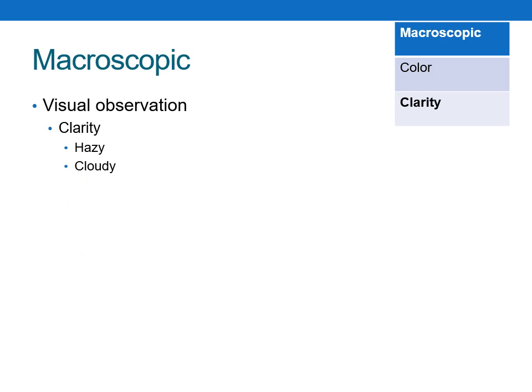That second part of the visual observation is determining clarity. So this test result can range from clear to hazy or cloudy. A normal test result would be clear. So anything within hazy or cloudy might signal an infection within the patient's GU tract. However, this is not specific enough to diagnose a UTI in the patient, and you should take into account the remaining UA results as well as patient symptoms and history.